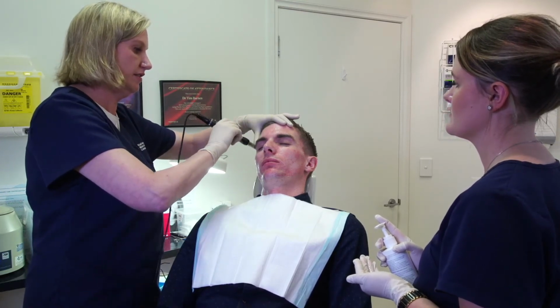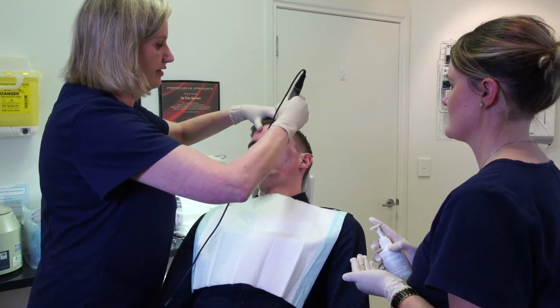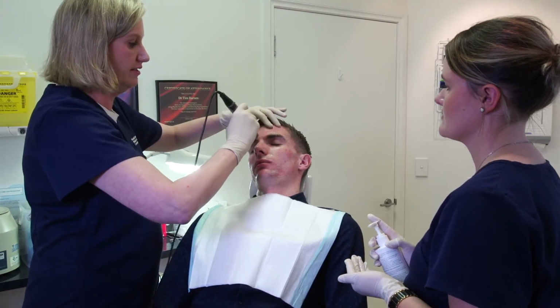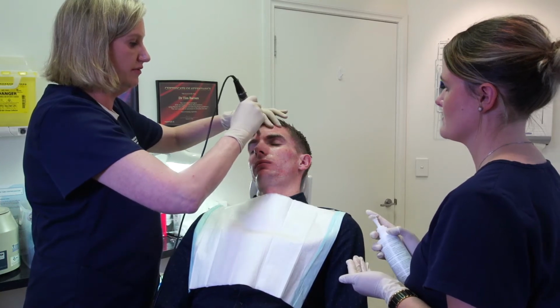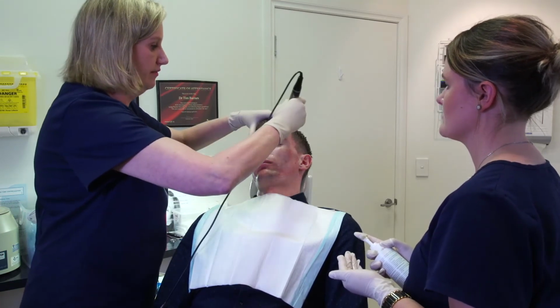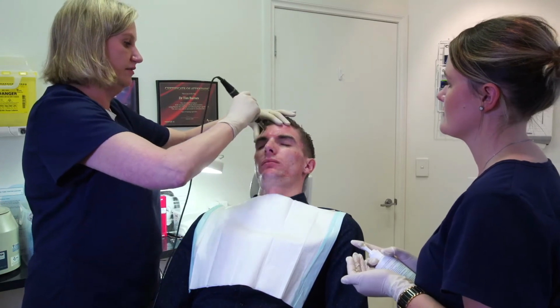Foreheads can be a bit more confronting, they can feel there's not much between the skin and the bone, so you really don't need to go more than 0.5mm depth in the forehead. And obviously it's good to address the sort of lines around here. Warn people this Dermapen does not get rid of action wrinkle lines, but it can help soften some of the early fine lines we get as a result of sun damage with age.